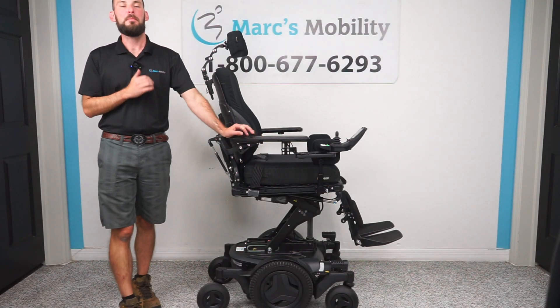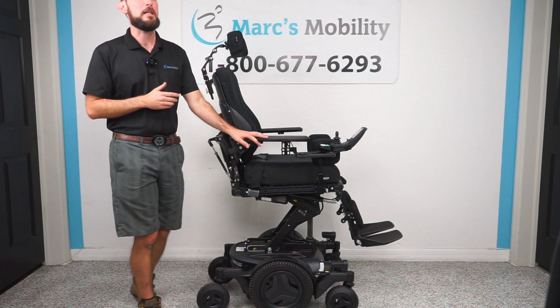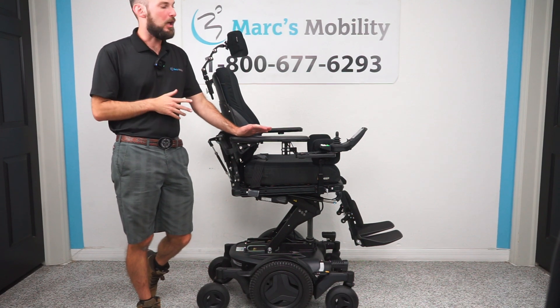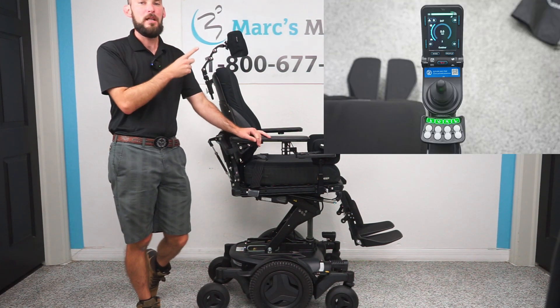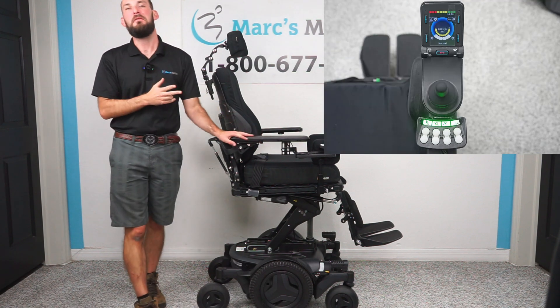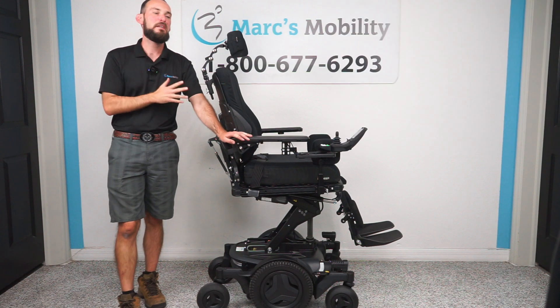This is the newer version of the Permobil — I have the M3 here. When I say a new version, I mean the updated electronics that came out around 2024. It looks like this; I'll have a picture up on the screen. If you have the older electronics that look like this, that is a different video — I'll have that video linked down below. These have a different process.